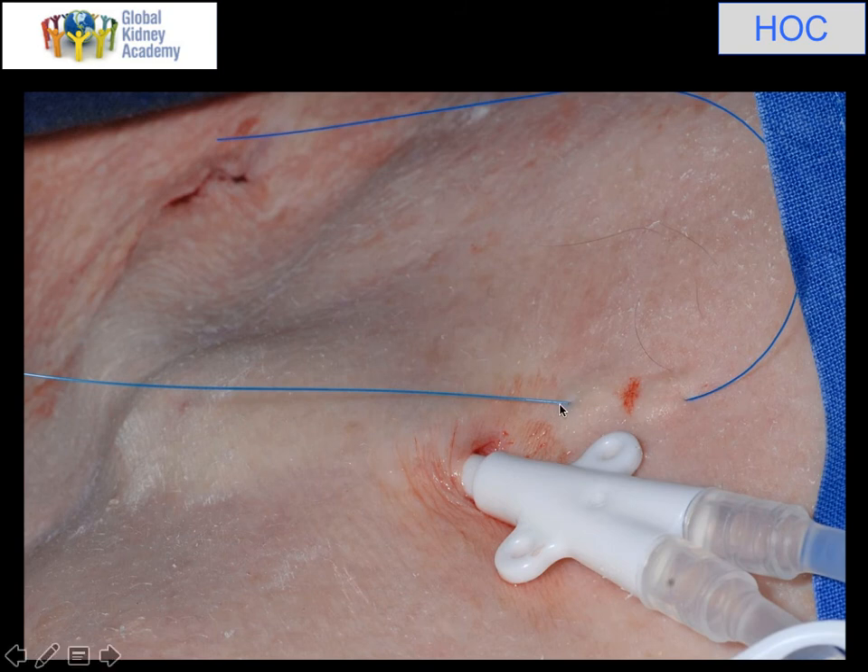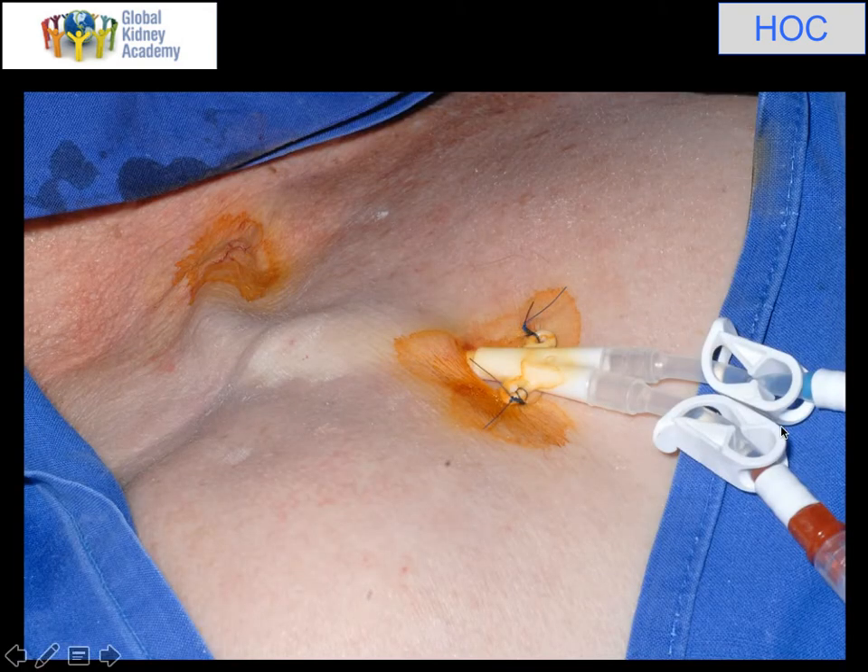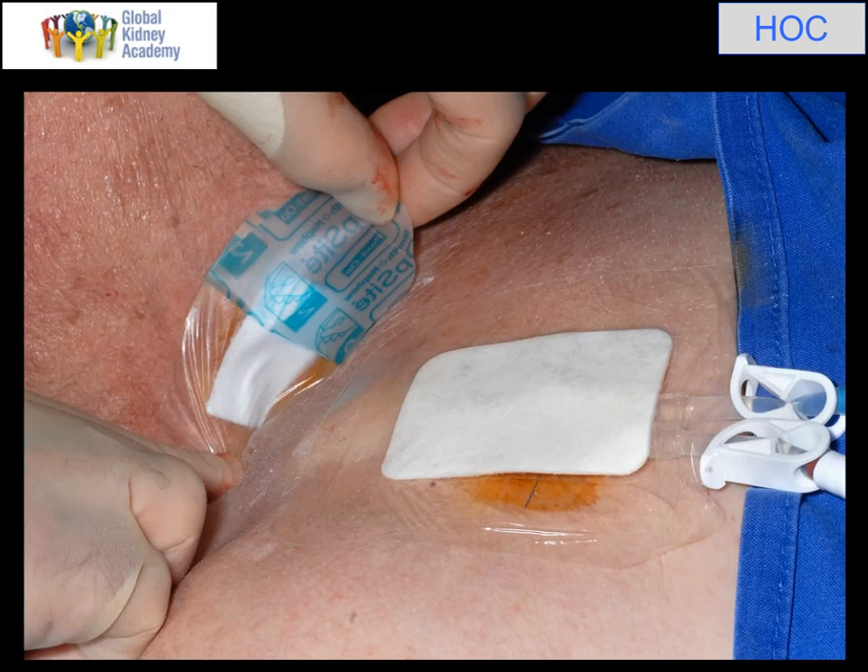For the second stitch I use ethylon, which is basically nylon — again a monofilament. I wouldn't use silk because first, silk is a foreign protein and causes an inflammatory reaction, which is fine for a temporary line for a few days but not good for a longer period of time. I've taken a nice big bite, first knotting it to the skin and then knotting it on each side using multiple knots — about eight or ten knots on each side — to fix it in place. We used to spray a bit of betadine, a bit of iodine, on the exit site and then cover it up.